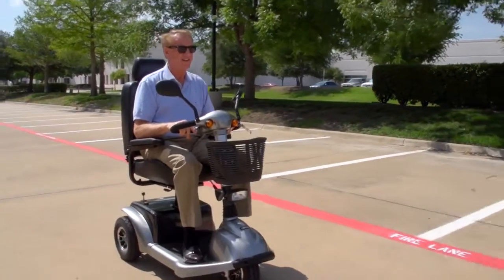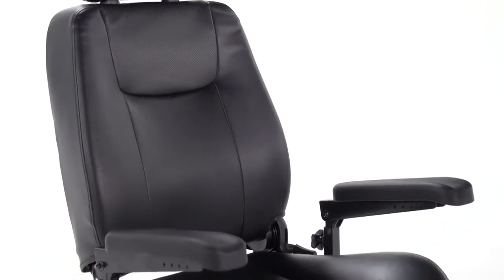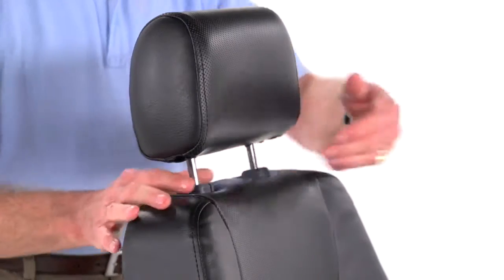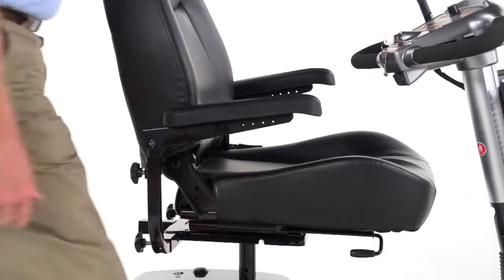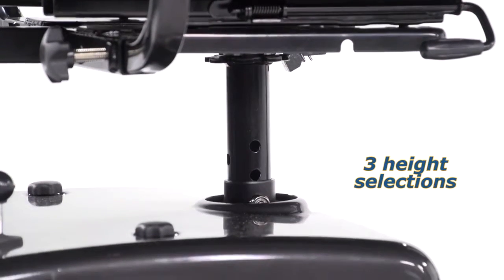Along with great performance, the Prowler offers superior comfort. The full-back captain's seat is available in either 20 or 22-inch widths with an adjustable height headrest. The seat can be adjusted forward or backward for the ideal driving location, and it offers three height selections to suit users of nearly any height.